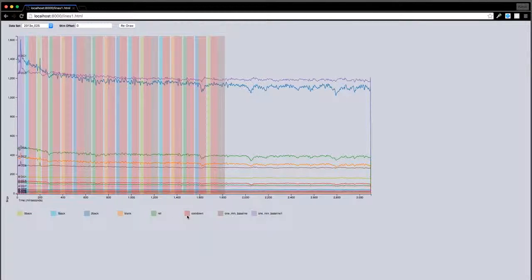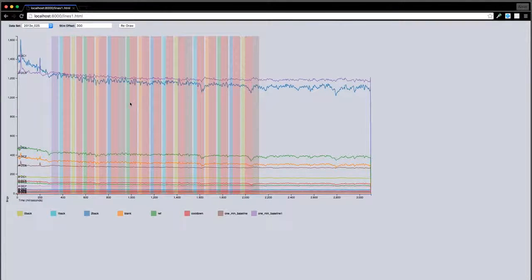So basically that's what these bars represented, the start and end of each activity. And each activity repeated multiple times, especially cooldown, you can see repeated a lot. But then you can see one back repeated, looks like 3 times during this test, and same with other activities. But like I was saying, there was no clear sync between the stimulus activity and the actual brain scan data. And so I added an offset up here, which allows somebody to redraw the graph with a certain millisecond offset on the brain scan. So here I'm going to add 300 milliseconds to the start of the stimulus data. So you can see that shifts it over to the right.